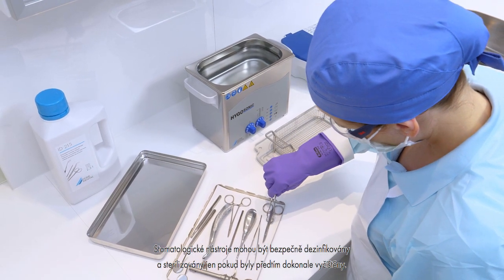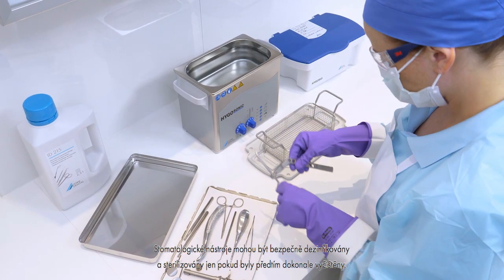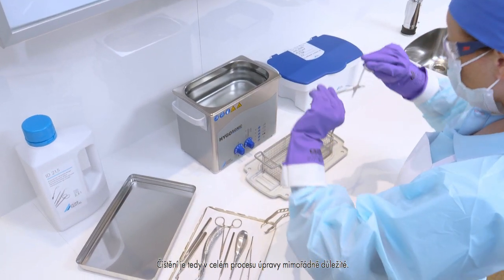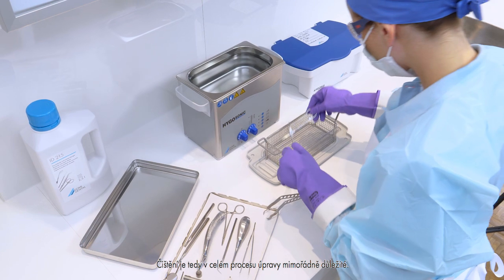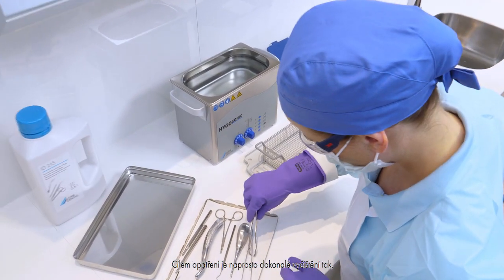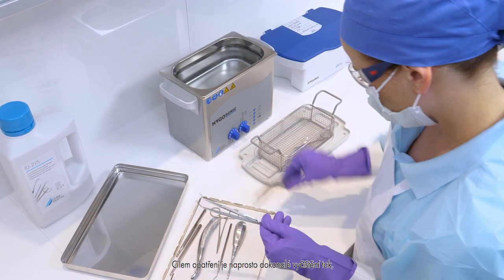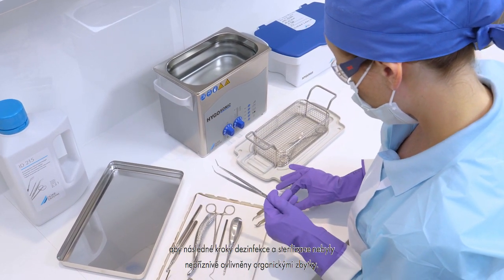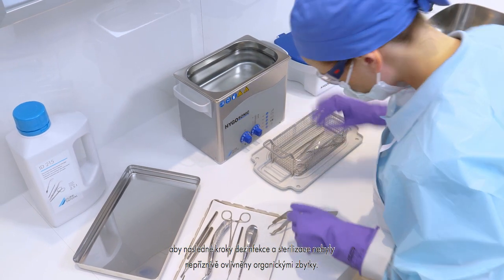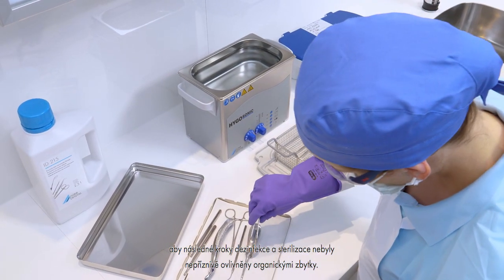Safe reprocessing of instruments can only be achieved with clean medical devices. The cleaning is especially significant in the entire reprocessing procedure. The objective of these measures is residue-free cleaning to avoid impairing the following disinfection and sterilization steps as a result of organic residues.